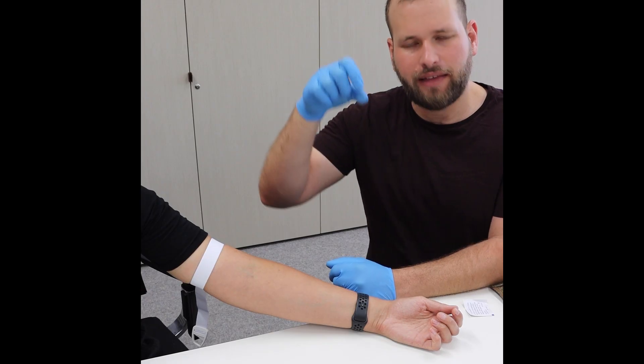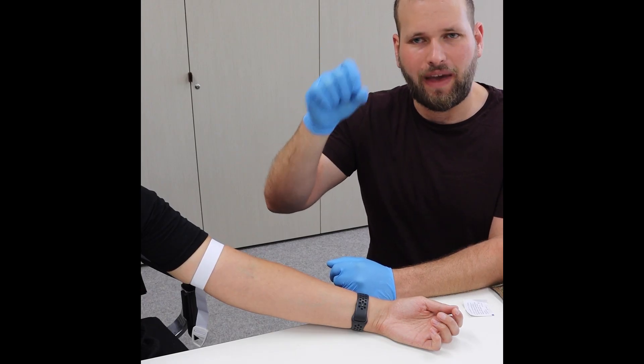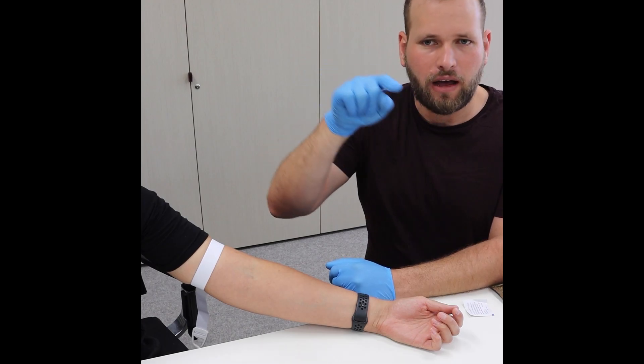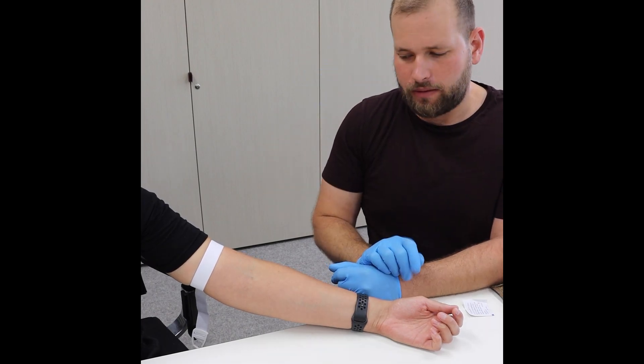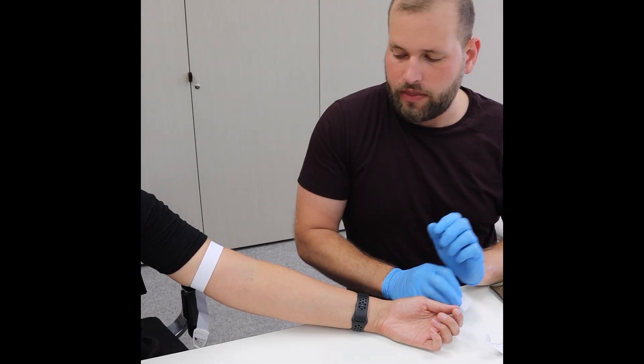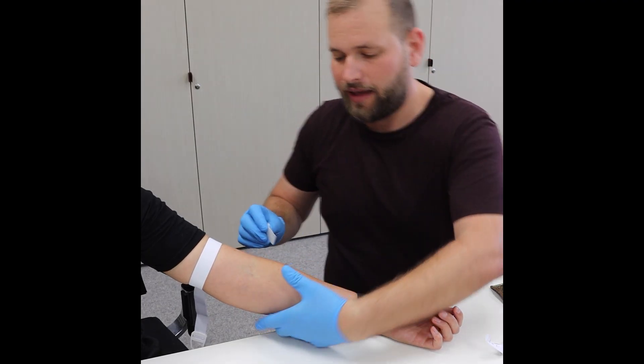What may have happened is the catheter may have hit a valve and what we need to do is a little trick to then open that valve and then allow the cannula to go in. I'm going to show exactly what that might look like and how we can actually save that cannula.